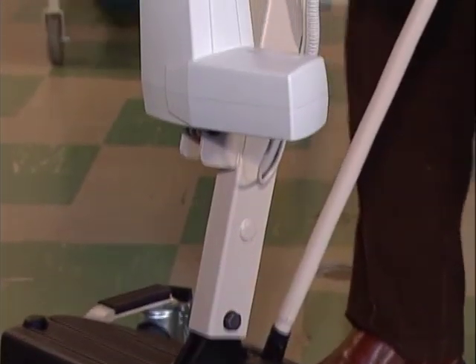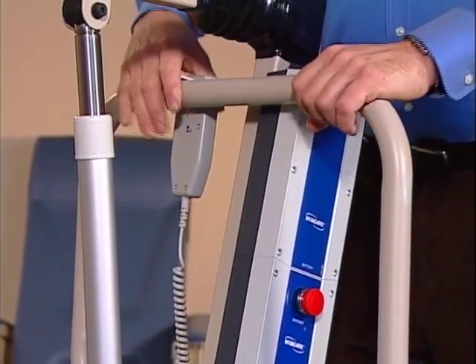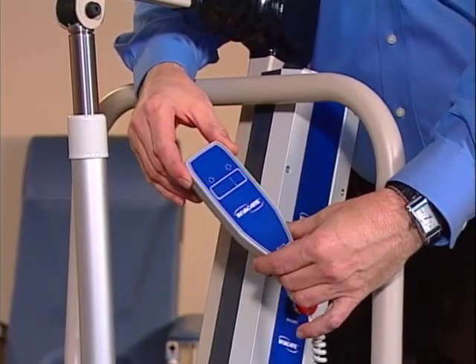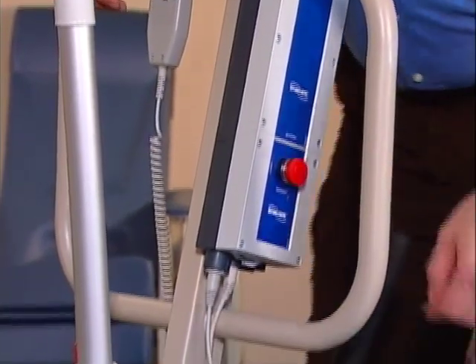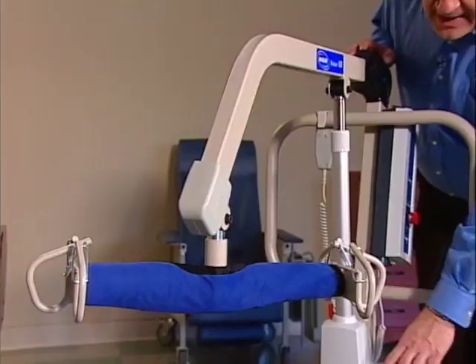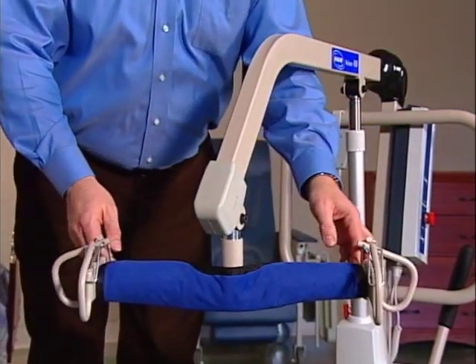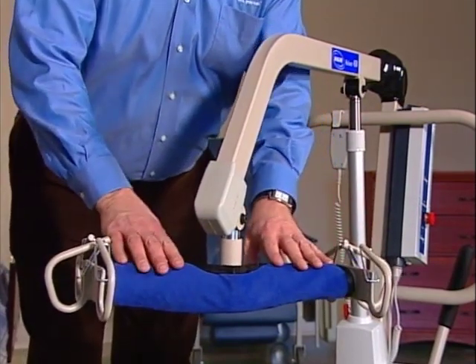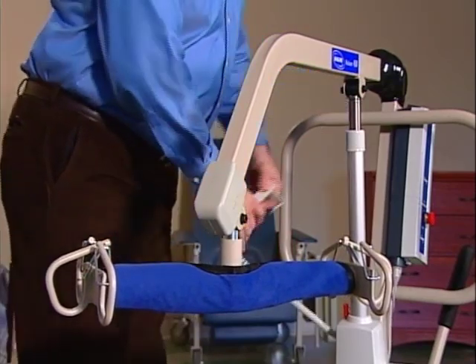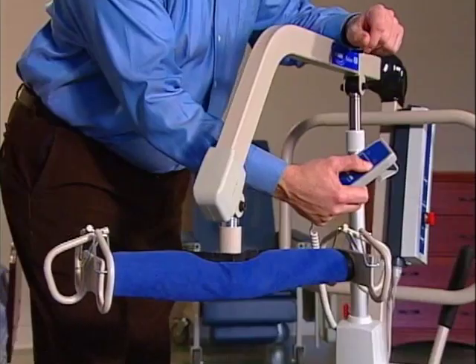The next assembly is the mast. Here you'll find these ergonomically designed push handles, a hand pendant which houses the operator's controls, the battery, a control box, and the actuator which actually lifts the patient. Attached to the mast is the boom — the lifting arm — and at the end of it is the swivel bar. The sling attaches to the swivel bar and it's padded for safety. The boom is operated using the controls on the hand pendant. With the push of a button, you can gently raise or lower the boom. It's very smooth and quiet.